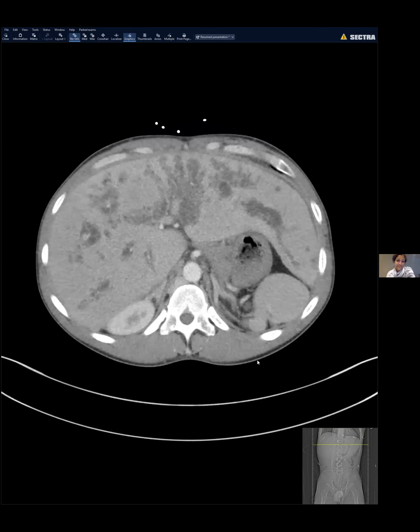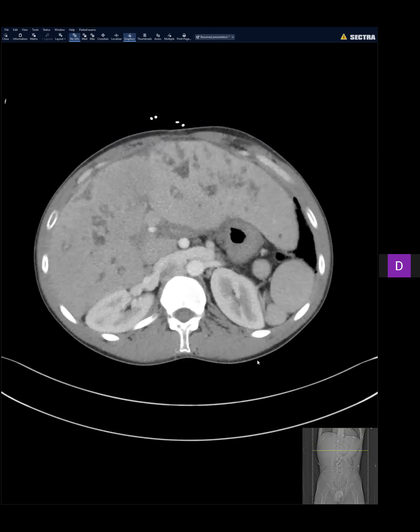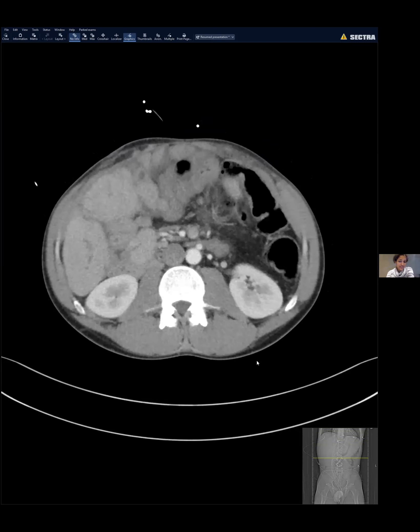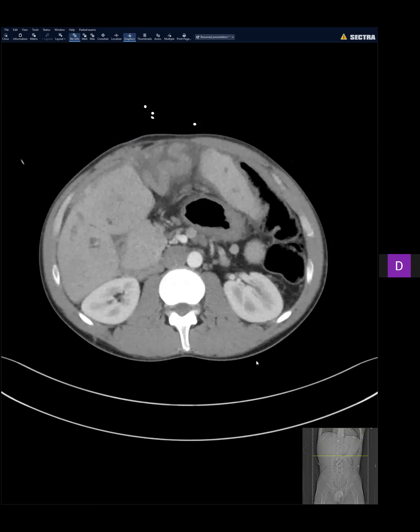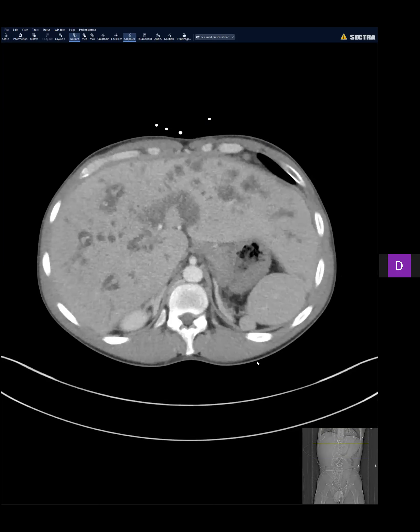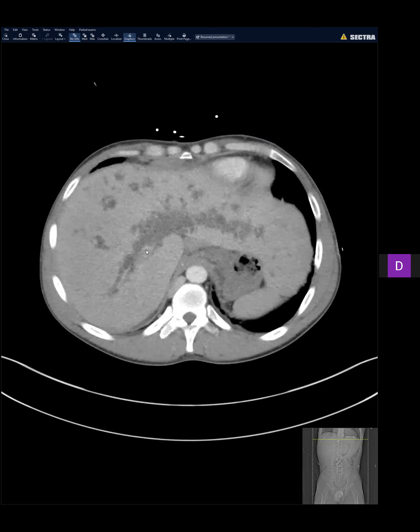The differential includes Caroli's disease, but this was not Caroli's. Can Caroli's be just periductal like this? Theoretically yes — they always say the differential for peribiliary cysts is Caroli's, but the two cases I've seen were more deep peribiliary, not towards the hilum, more towards the mid portion of the liver. The portal vein is patent, just with a little mass effect on it from the extensibility changes.